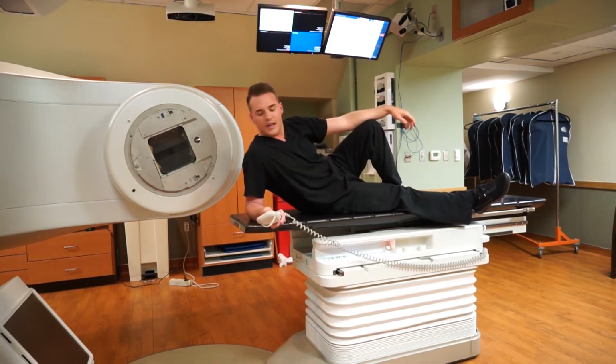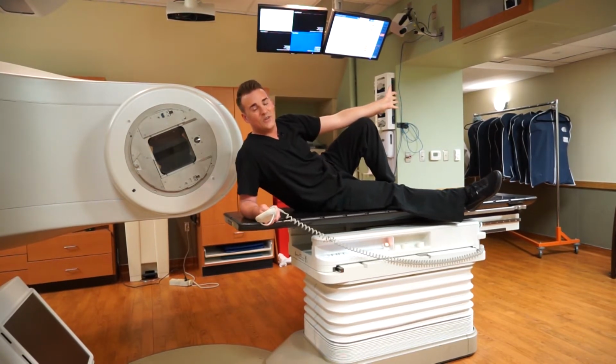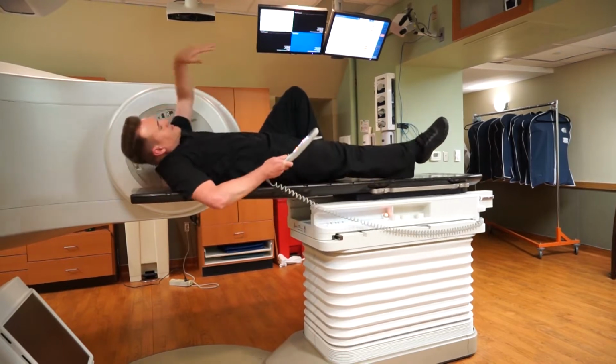Now, if you want to... do not turn it off yet. I'm not done. We want to get the patient into position, so we're going to raise the table and move it up to get him treated, just like so.